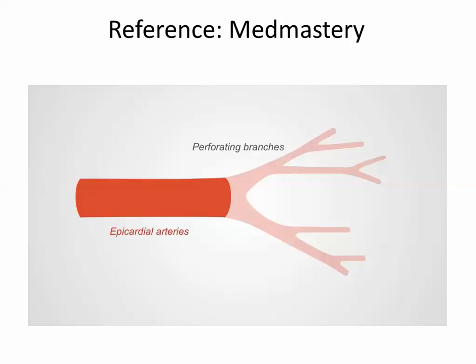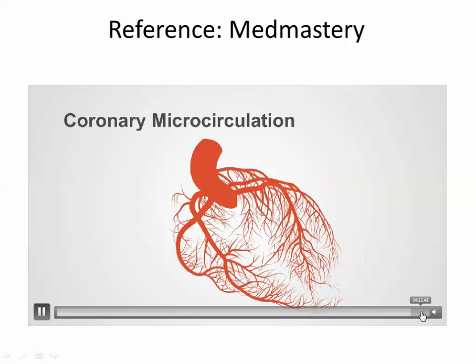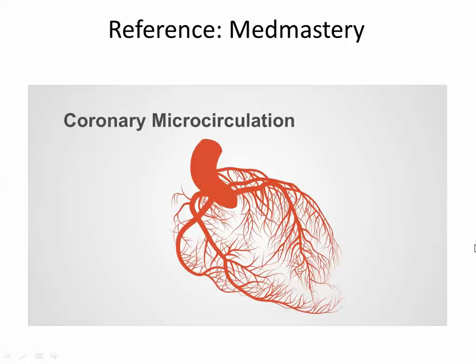There are many trials on it, and no proven medication. We give a calcium channel blocker, and sometimes decrease the beta blocker or stop it. So this is the final picture. This is anastomosing, with two circulations, the interventricular and atrioventricular.